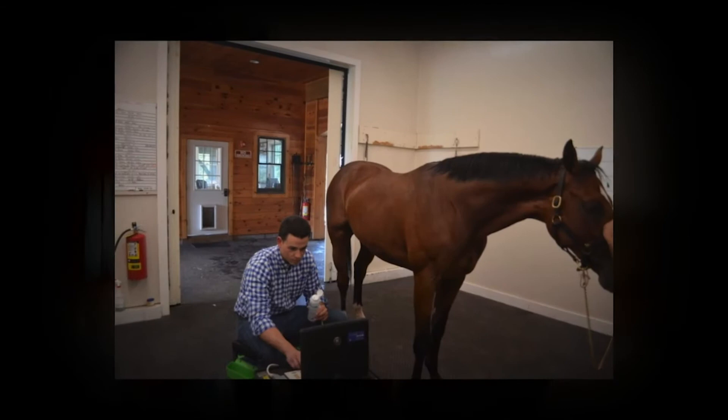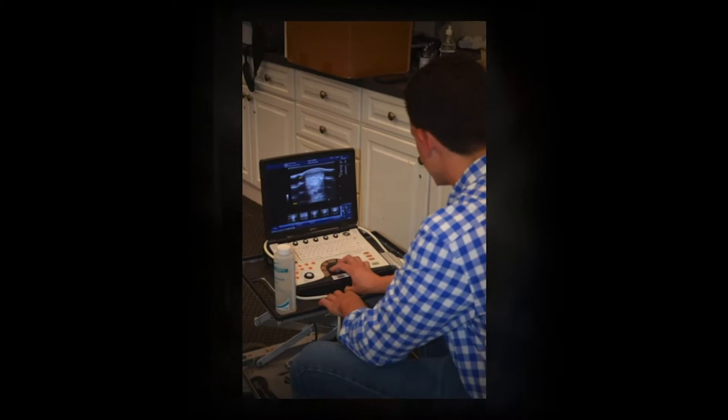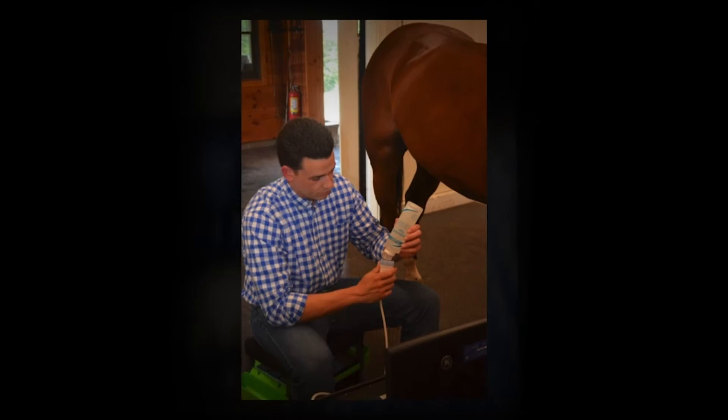The other nice thing about Clarity Ultrasound Gel is its consistency and viscosity. Instead of pushing ahead of my probe and falling off a horse's leg and me constantly having to reapply it, it manages to flow under an ultrasound probe or flow under a shockwave probe so you're not constantly reapplying, and gives an image that's much more similar to a wet skin with alcohol versus traditional ultrasound gels.